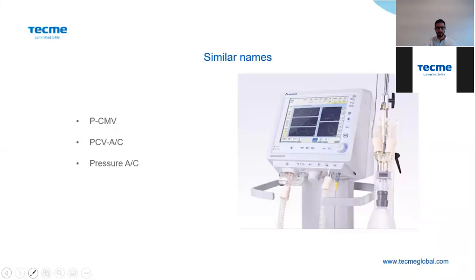Here we go. The first one is, if the patient's lung compliance decreases, what will happen to the inspiratory volume? And then, which alarm do you consider the most important in this ventilatory mode? We will take 1 minute for this question.